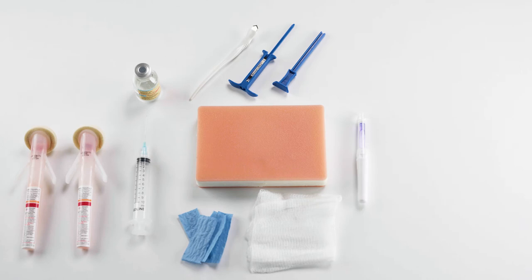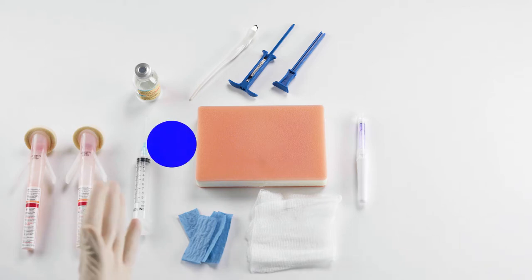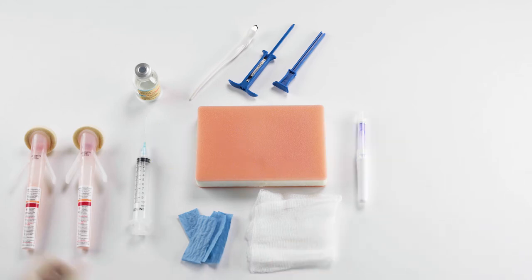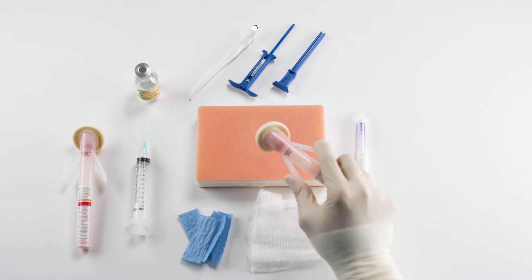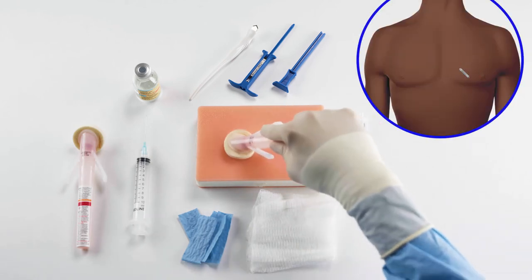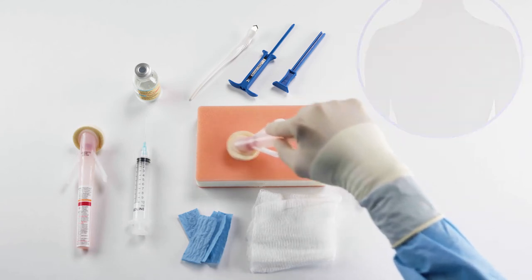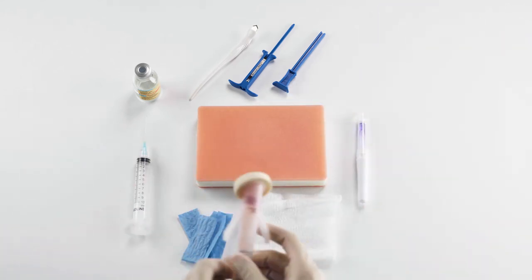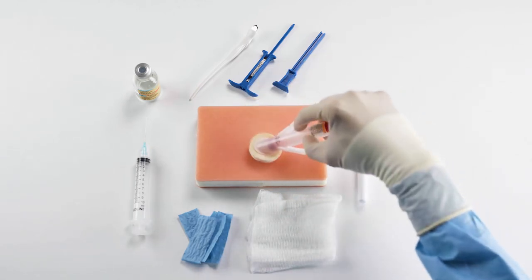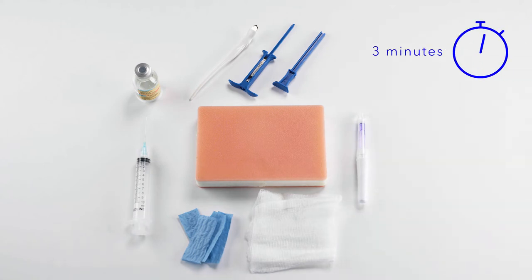We've arrived at the minor procedure room in preparation for the Medtronic Reveal Link insertion procedure. Our patient is resting comfortably on the stretcher. I am standing to their right — their head is to my left and their feet are to my right. We've exposed the chest in preparation for the skin chloroprep. I'm going to find the left chest area, crack the chloroprep, and begin small circles to big circles to prepare the skin. We're going to repeat this process one more time and allow that to dry over the next three minutes.